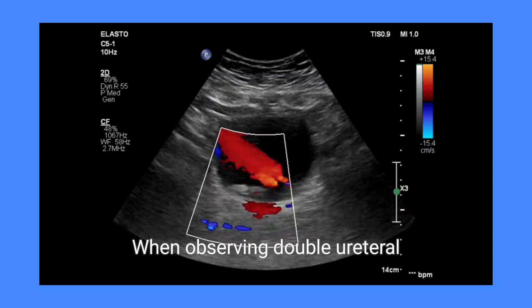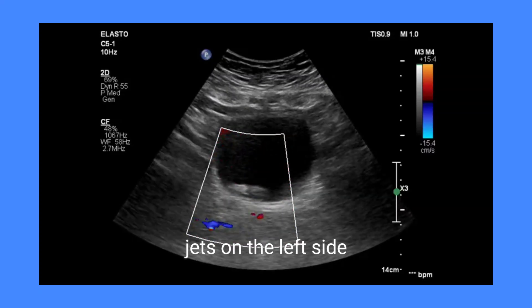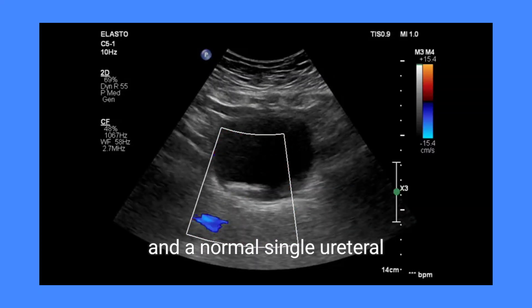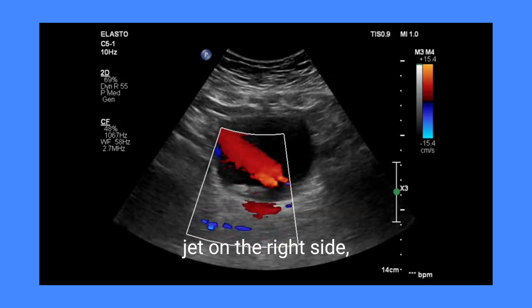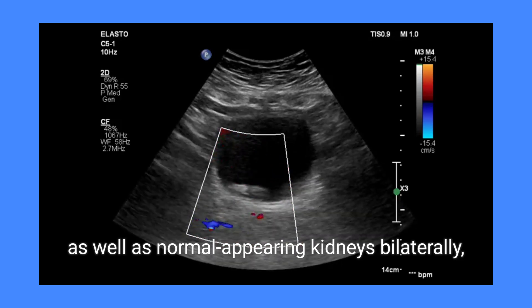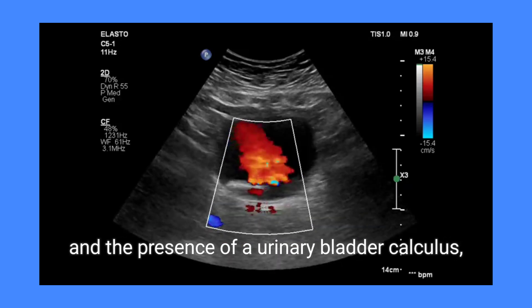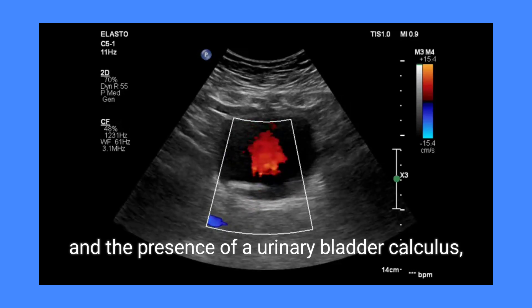When observing double ureteral jets on the left side and a normal single ureteral jet on the right side, as well as normal appearing kidneys bilaterally and the presence of a urinary bladder calculus, several diagnostic possibilities arise.